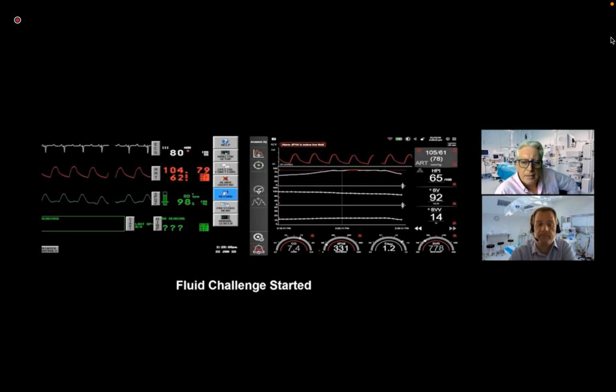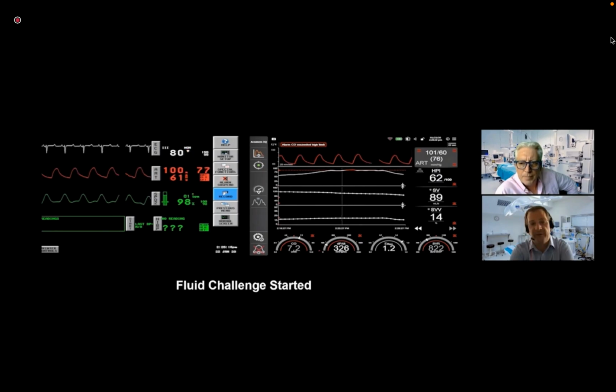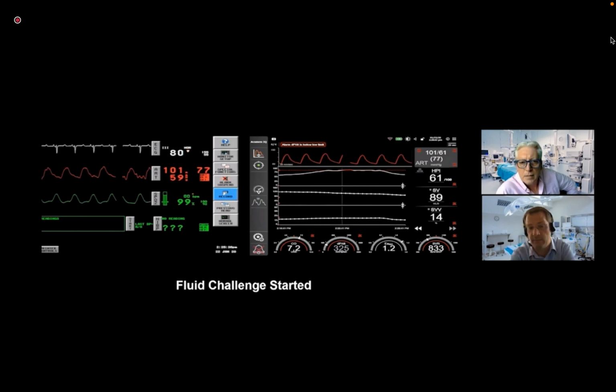So what if the Ea dyn was 0.8? Because they still need volume, don't they? Absolutely. It tells us just as much information. It's telling us that, well, we need fluid, our SVV is raised, we're hemorrhaging, but that fluid's not going to fix our blood pressure problem. So at that point, you're thinking, well, I'll give the fluid because we need to improve flow. We're also going to need something else to improve blood pressure or maintain blood pressure.